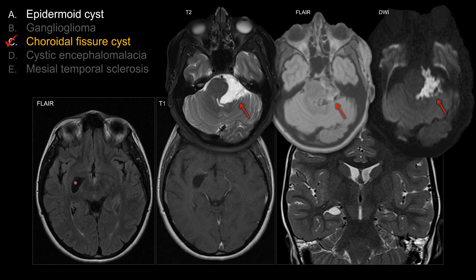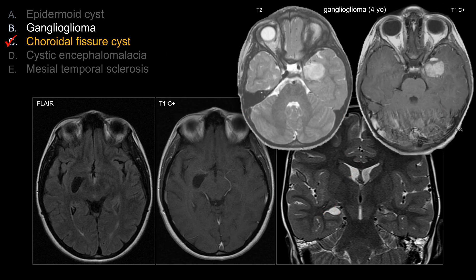Unlike a choroidal fissure cyst, which should follow CSF signal intensity in all sequences, an epidermoid cyst shows incomplete FLAIR suppression. Classically, epidermoid cyst also shows restricted diffusion, whereas a choroidal fissure cyst should not. Choice B is ganglioglioma.